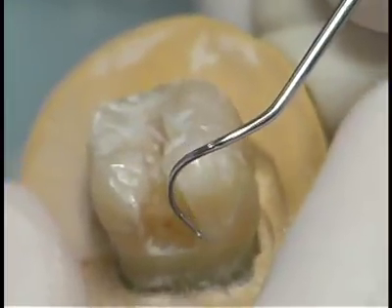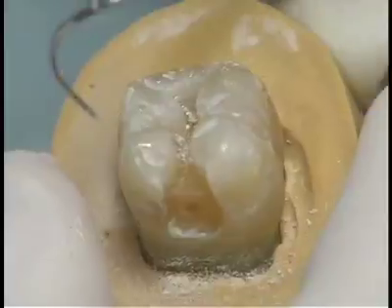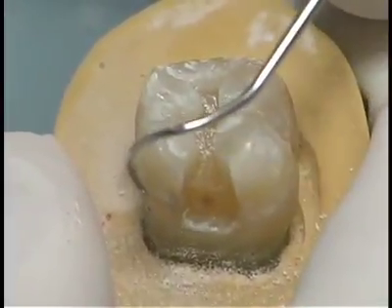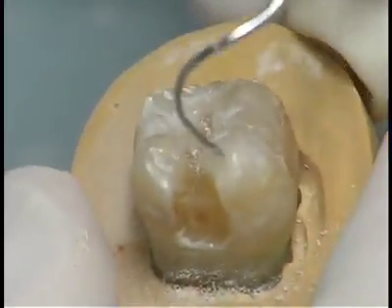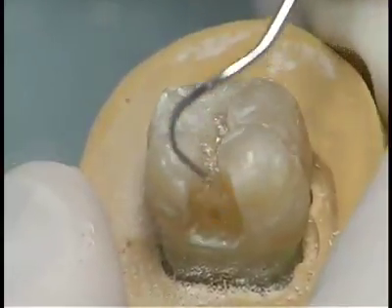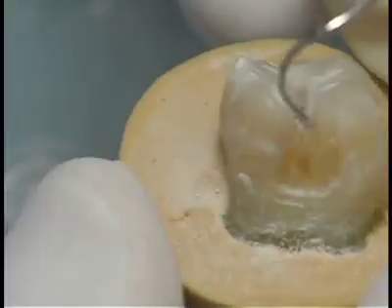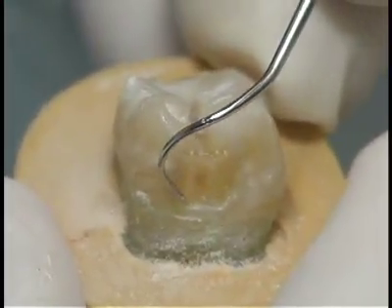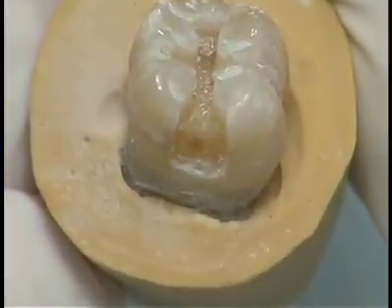The buccal proximal wall is 90 degrees to the cavosurface margin of the tooth structure. The lingual wall is 90 degrees to the tangent of the tooth structure. There is an acute angle at the buccoproximal and lingual proximal walls. The gingival cavosurface margin was planed and unsupported enamel removed. The Class 2 cavity preparation is complete.